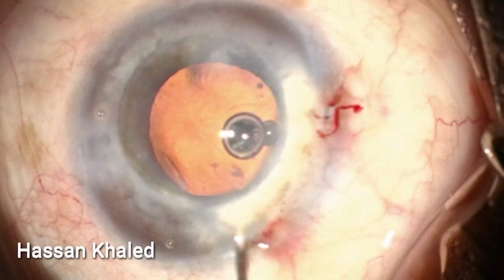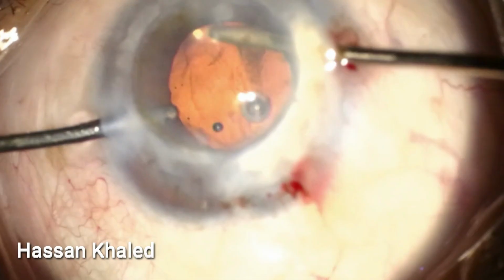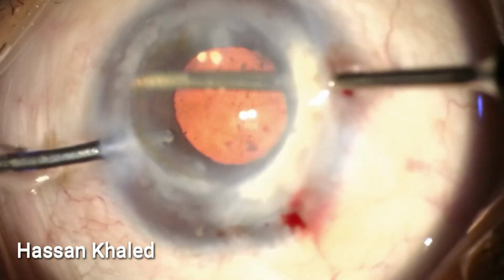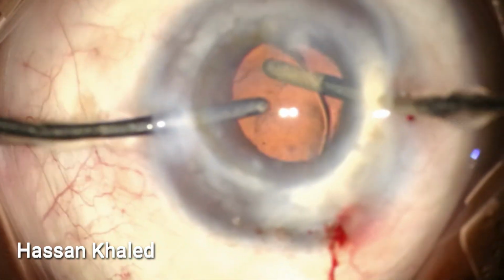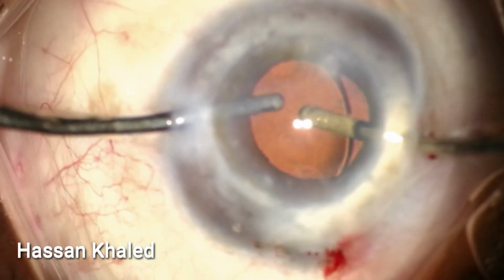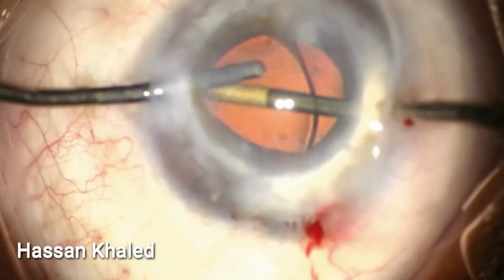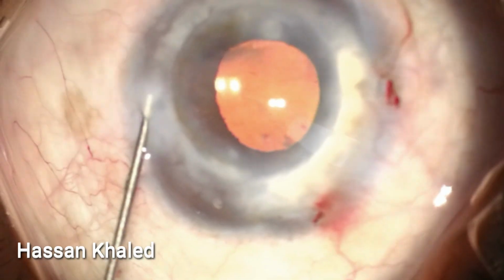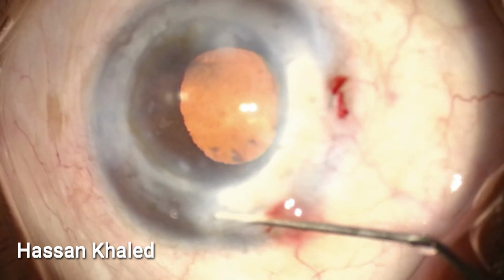Then forming the capsular bag and the anterior chamber with cohesive OVD and implanting a single-piece hydrophobic IOL inside the capsular bag, away from the back of the cornea. It's secured properly inside the capsule. I prefer to avoid the AC IOL and also the sulcus IOL in those cases. Then stromal hydration through the host cornea.